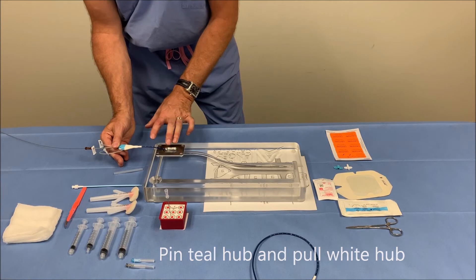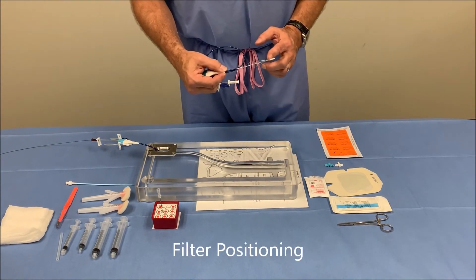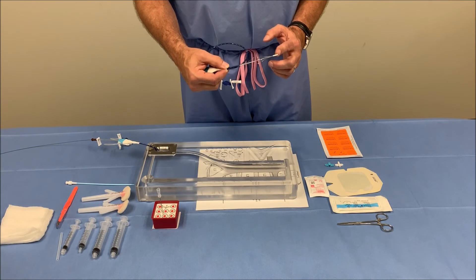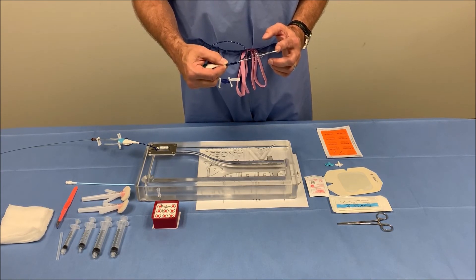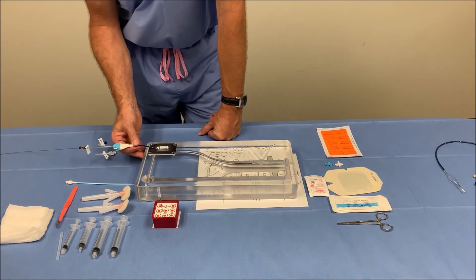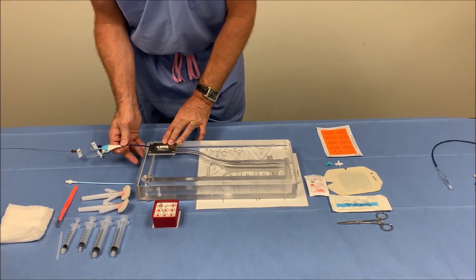When finished deploying the filter, you should always have approximately 7 centimeters of the catheter outside the access site. Optimal placement of the filter is having the apex of the filter below the level of the renal veins, typically around L2. This can be accomplished by identifying the radiopaque marker at the distal tip, placing it right at the top of L2, positioning the apex of the filter correctly. It may be necessary to reposition the filter prior to securement, which can be done by utilizing the centimeter markings on the catheter and pulling back to the desired location.